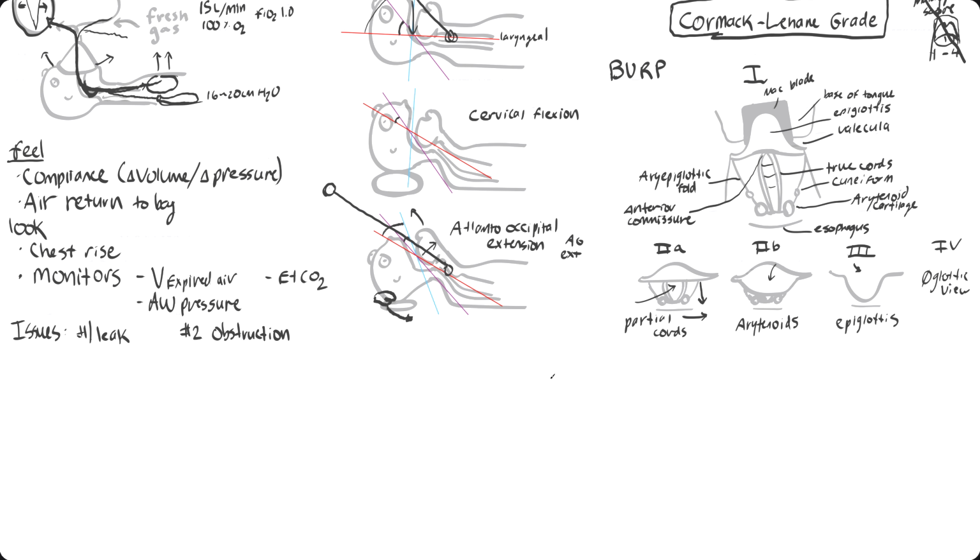I realized I've pretty much gone over everything except actually placing the endotracheal tube, so just a note on that. So this is your endotracheal tube. It'll have its connector up top and a cuff here with somewhere to inflate your cuff. I'm going to hold this about 2/3 of the way up, or closer to the top than the bottom, so that you don't have to change position of where you're holding this when you insert it to an appropriate depth. And that depth for men is about 23 centimeters. And tube should be about 21 centimeters for women.